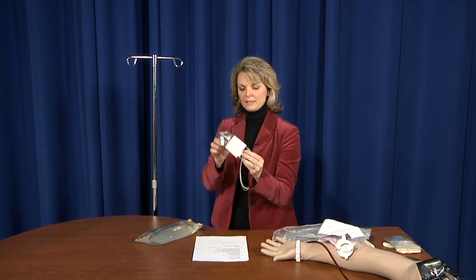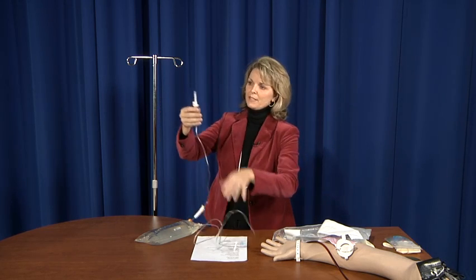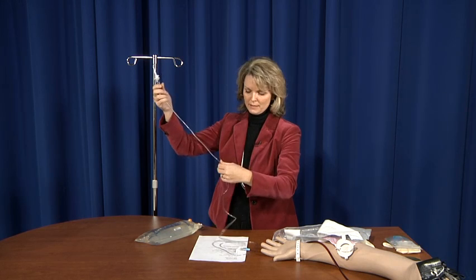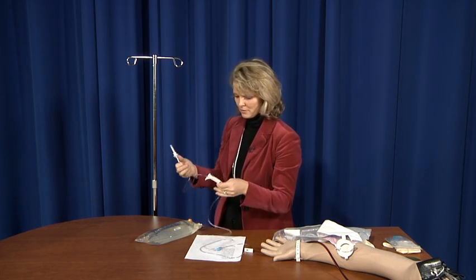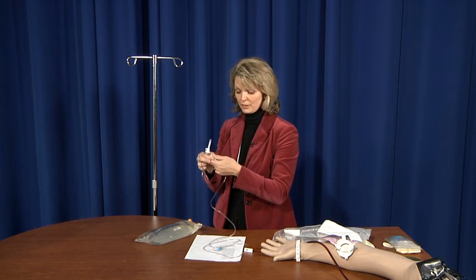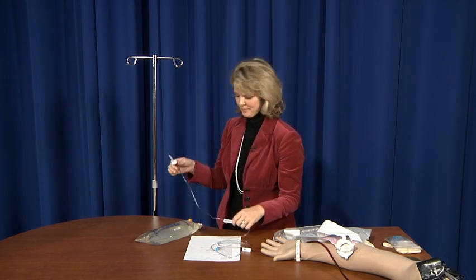And this is what it looks like. It's got a piece of paper around it to make it all pretty. So we're going to discard that. And this is what it looks like. You've got the spike, the drip chamber, the tubing, the roller clamp, and then your hub. So the first thing we're going to do before we spike our bag of fluid is roll our clamp down. What this is going to do is prevent the fluid from coming into our drip chamber down our tubing, because we don't want it on the floor.